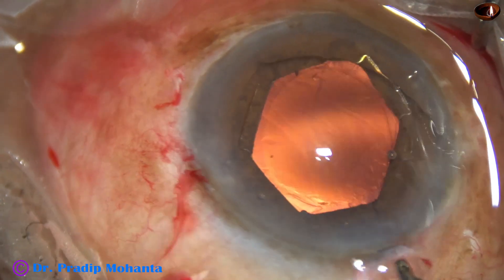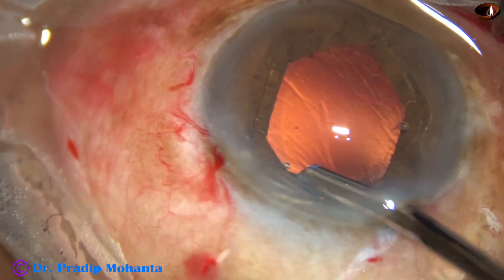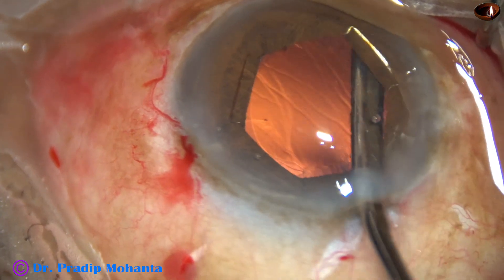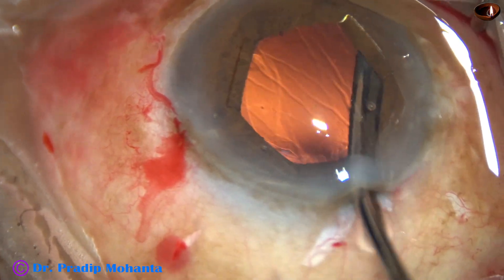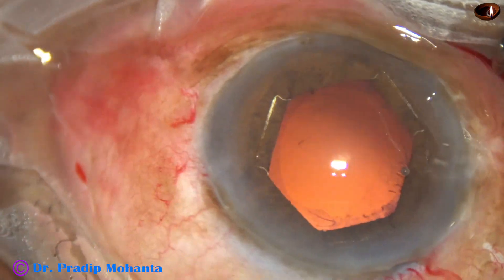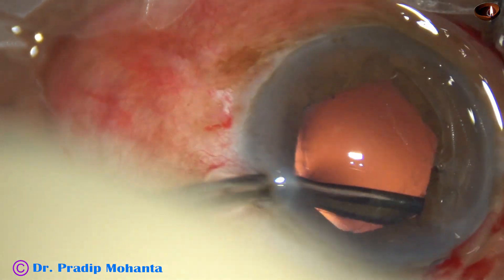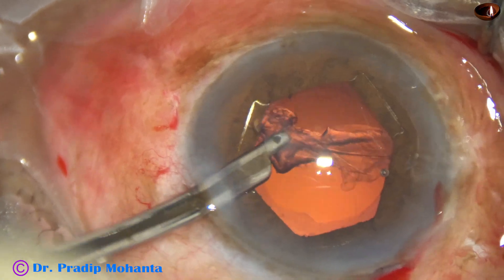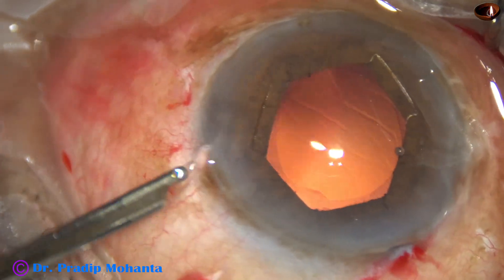I am using a 23-gauge Simcoe to remove the cortex. A lot of cortex is hidden under the iris. We move the Simcoe side to side and try to catch hold of the anterior part of the cortex and pull gently — very gently. Just hold the anterior part and pull it towards the center. At this time we have to be careful: the zonules are weak and we should not hold the capsule and pull it.